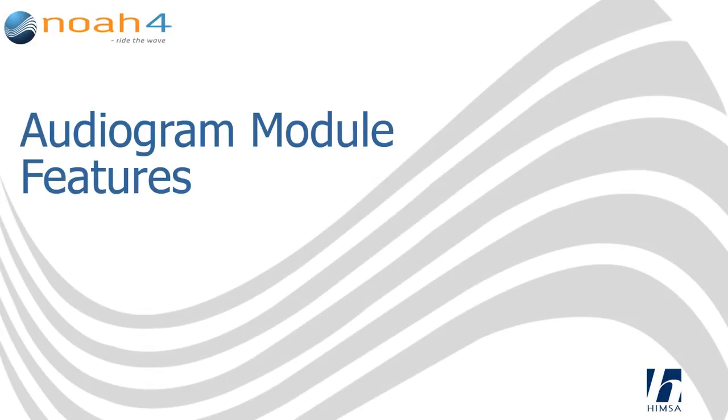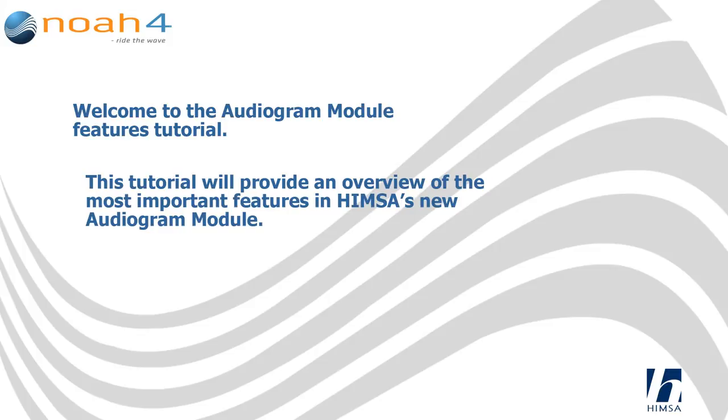Audiogram Module Features. Welcome to the Audiogram Module Features Tutorial. This tutorial will provide an overview of the most important features in HIMSA's new Audiogram Module.